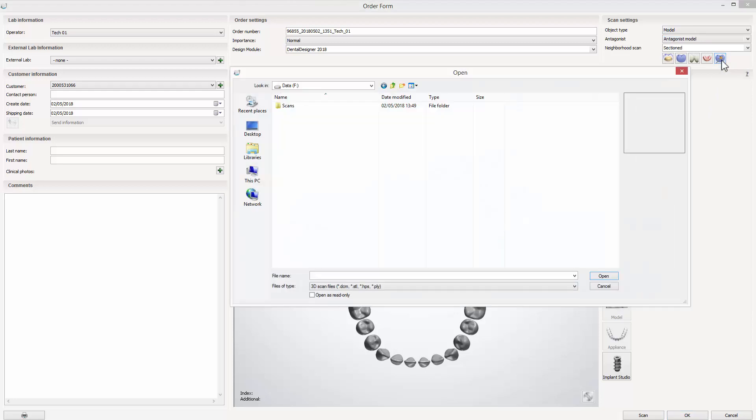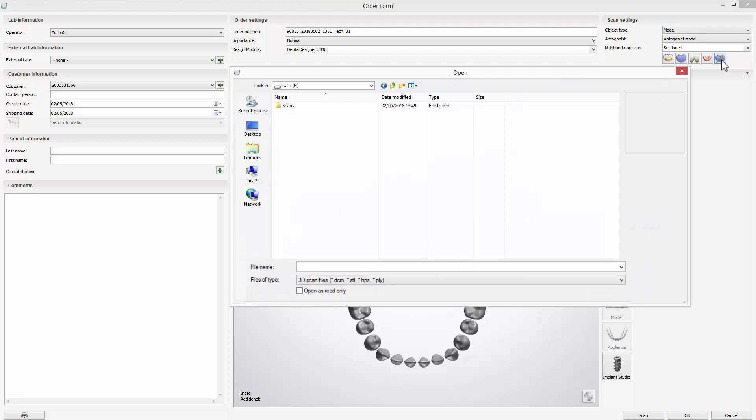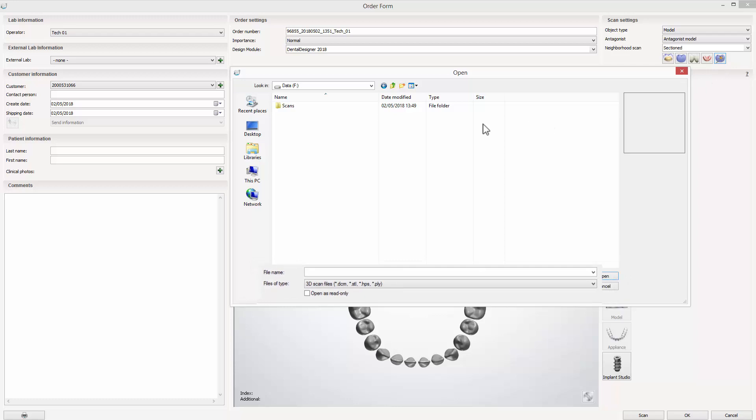That function supports the following four formats of file: DCM, STL, HPS, and PLY.